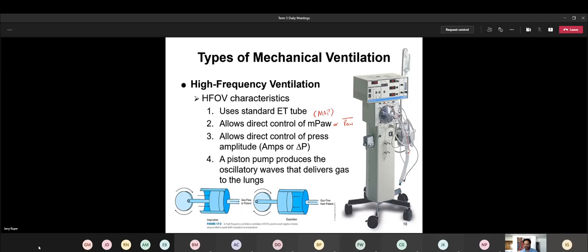But in other situations, you're probably not going to be that concerned, because especially with an air O2 blender system, you're always going to be using an O2 analyzer. And that goes for any situation in a nursery. If you're using a blender, you're also going to need an O2 analyzer that tells you exactly how much FiO2 this system is delivering, not what's on the dial.